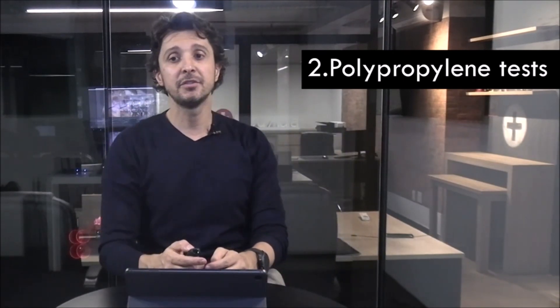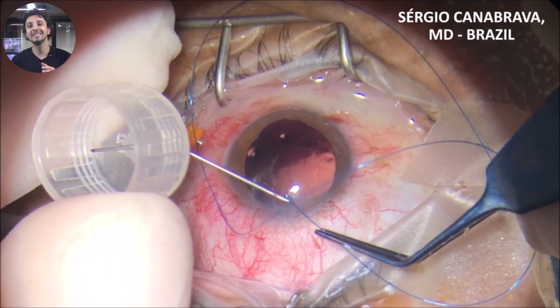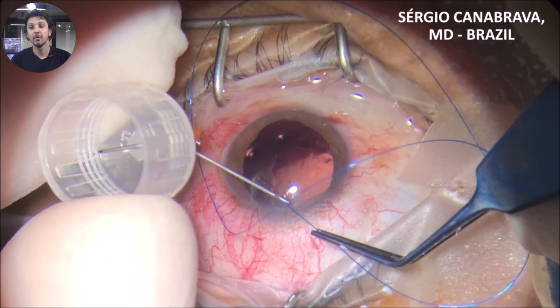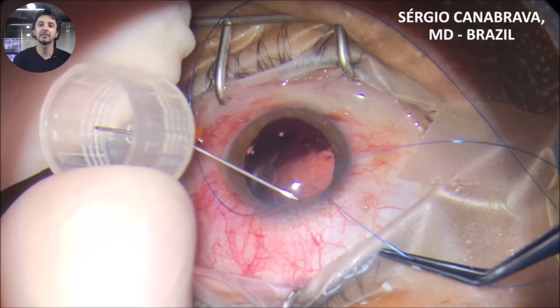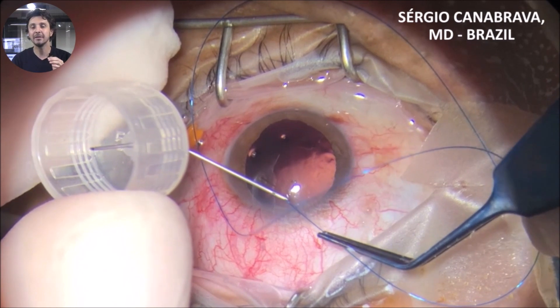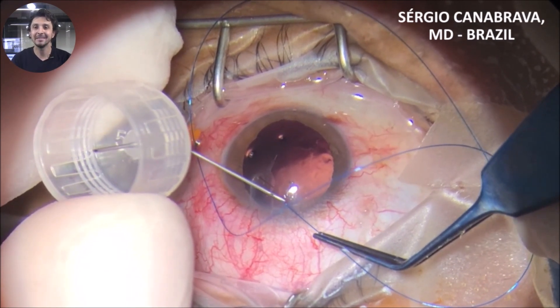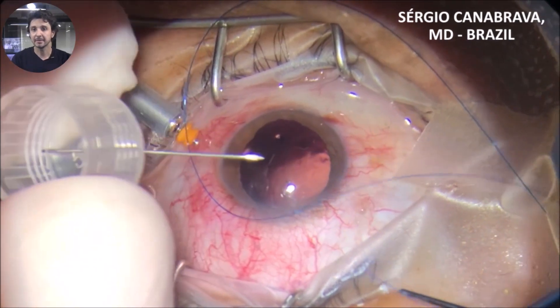Tip 2: polypropylene tests. As you can see in this video, it is important to test the polypropylene inside the needle and outside the eye before surgery. It's important because sometimes you try to insert the polypropylene inside the lumen of the needle and it does not happen.